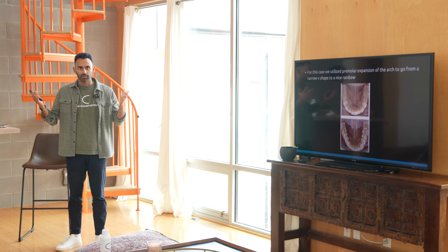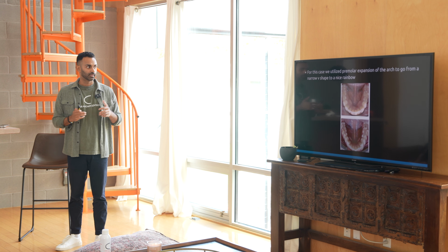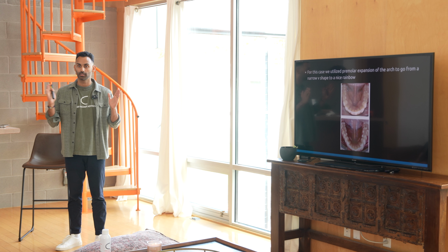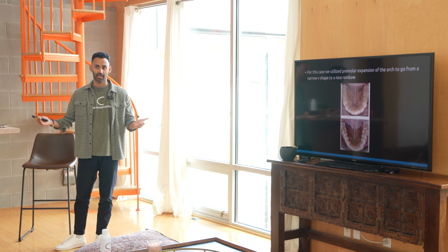And I was like, what do you mean? I was like, everything expanded. Like, of course it did. She's like, no, they didn't. She's like, your premolars moved, and that's how you got the space. But the planned millimeter of molar expansion didn't actually happen.